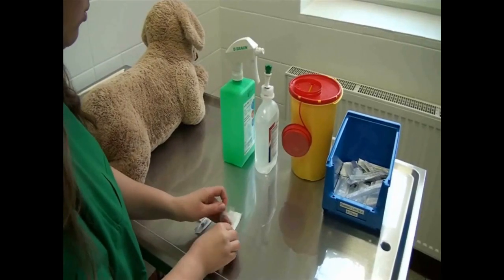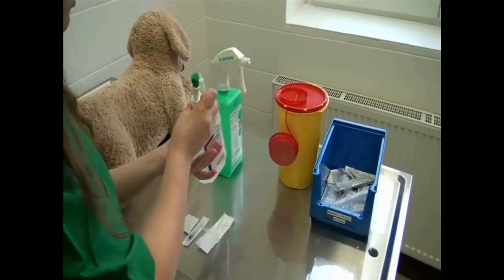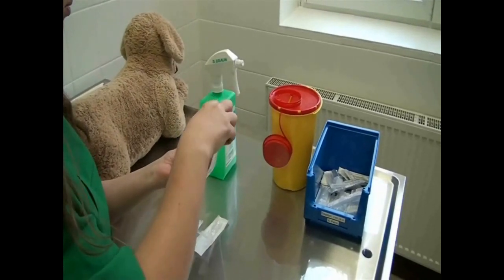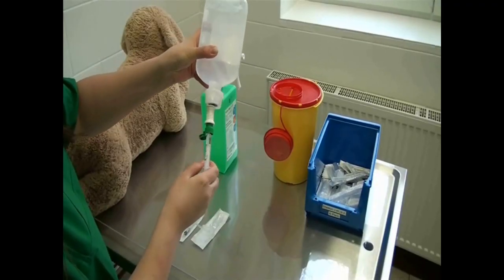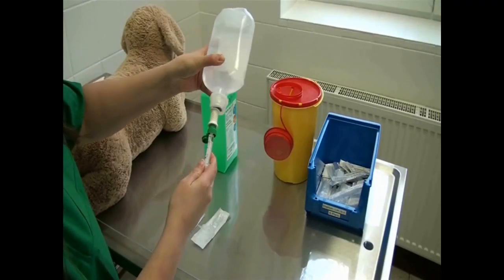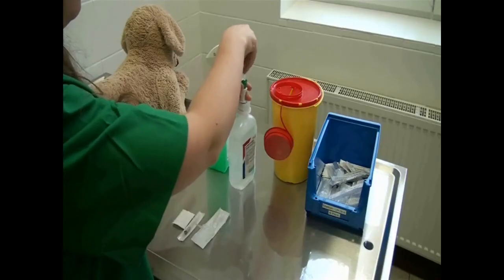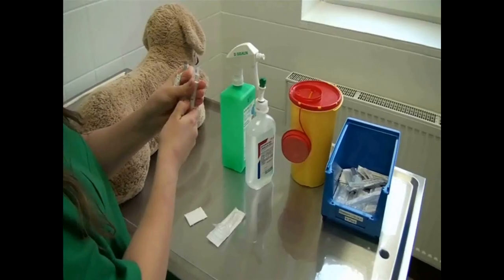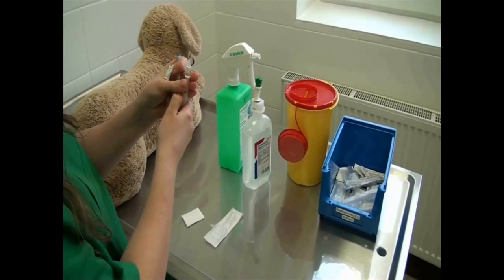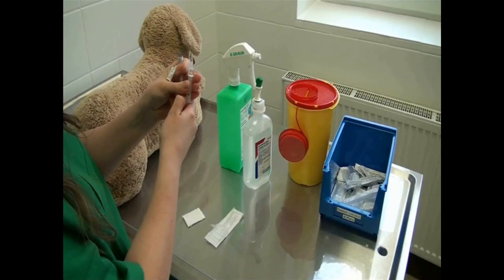Prepare the syringe by drawing up the calculated volume of injection solution. In the live patient, the animal should be restrained by an assistant and distracted during injection. Before attaching the needle, remove any air bubbles from the syringe.